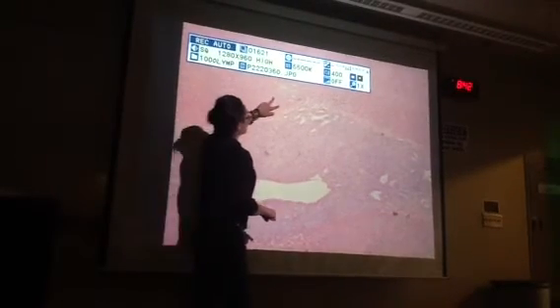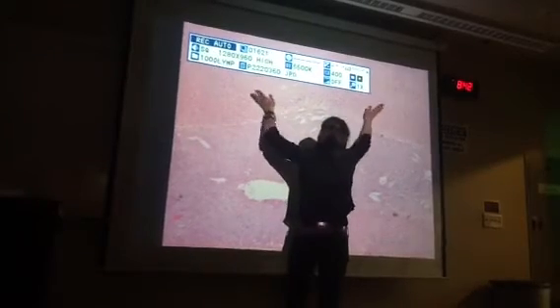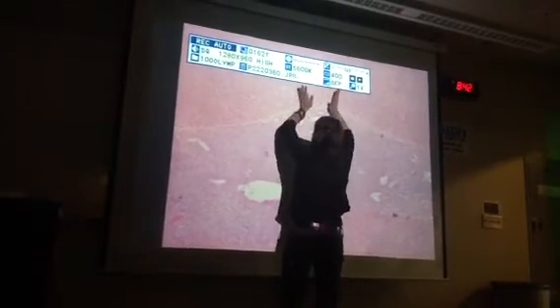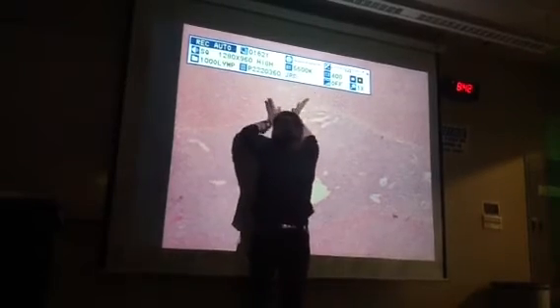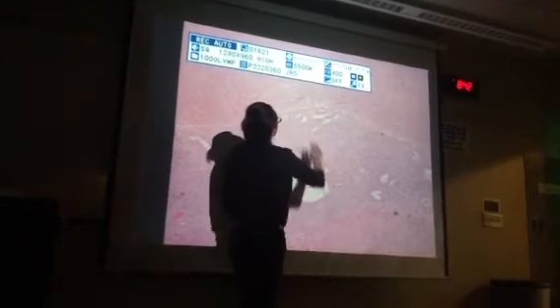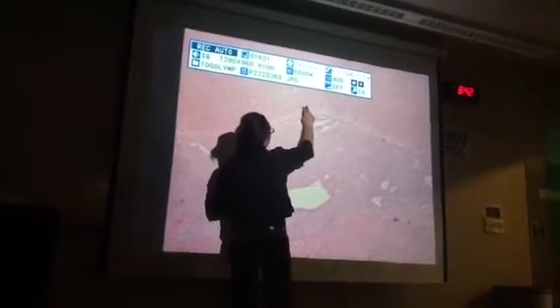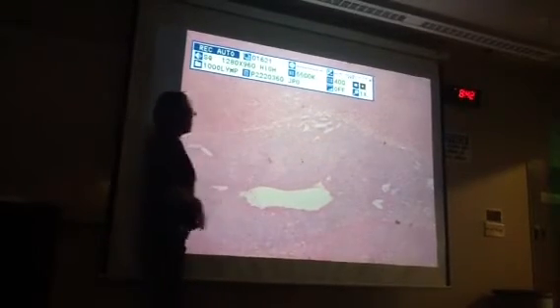The other thing about reticularis is the cells are going out at angles a little bit instead of running straight up and down or being swirly. They radiate out a little bit. And reticularis is going to have more spaces in here, lots of capillaries in that particular layer.